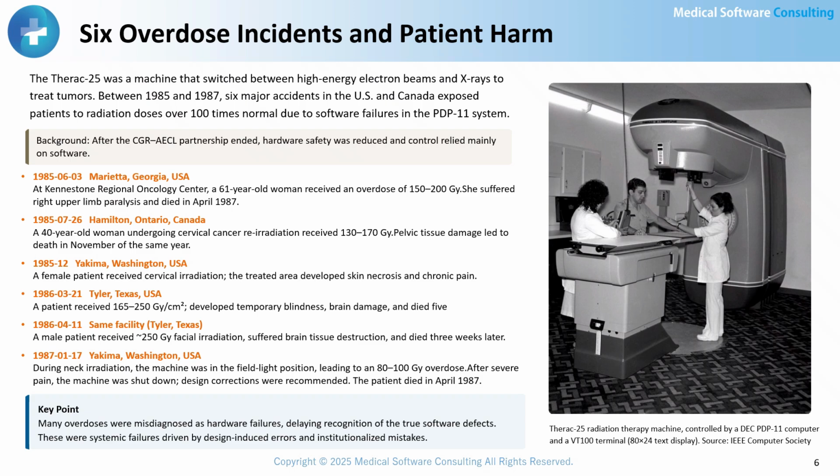Systemic failures. Victims' symptoms, burning, paralysis, or skin damage, were often mistaken for routine side effects. Only after repeated cases at different hospitals was the machine itself blamed. AECL's response was slow and dismissive, attributing reports to operator error and overlooking design flaws. Critical hardware protections had been removed under the assumption that software was reliable. The lack of rigorous engineering, combined with poor communication between manufacturer, hospitals, and regulators, allowed lethal defects to remain for years.